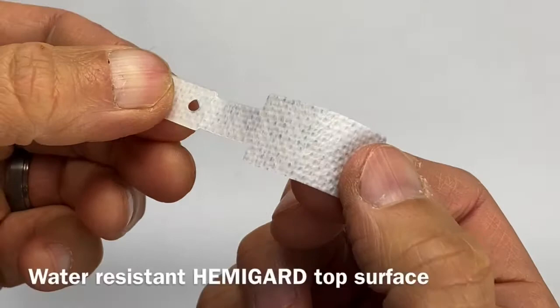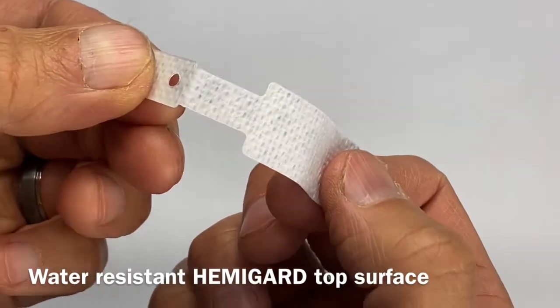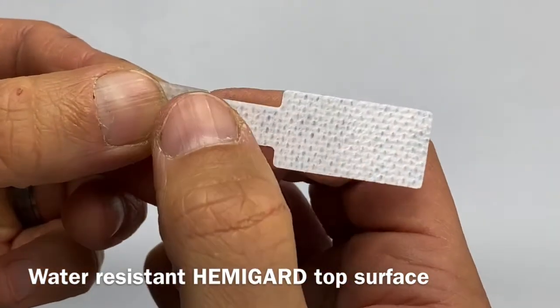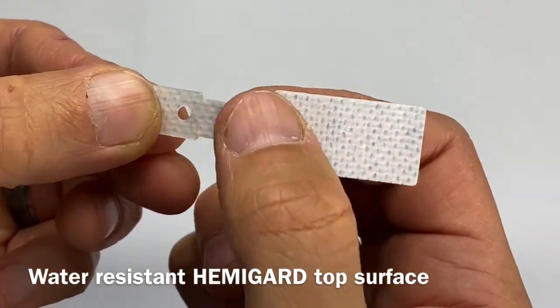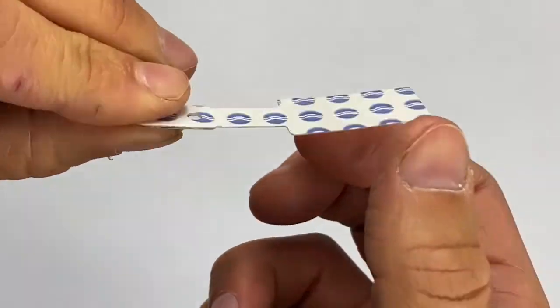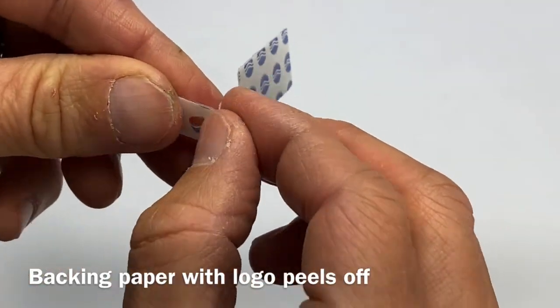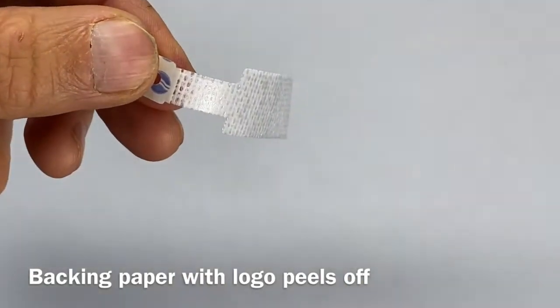There is a top portion that extends approximately three-quarters of the length of the HemiGuard that's water-resistant and allows easy wiping. On the back of the HemiGuard, which is the adhesive portion, there are two pieces of backing paper. I'm just going to remove one of the backing papers right now.